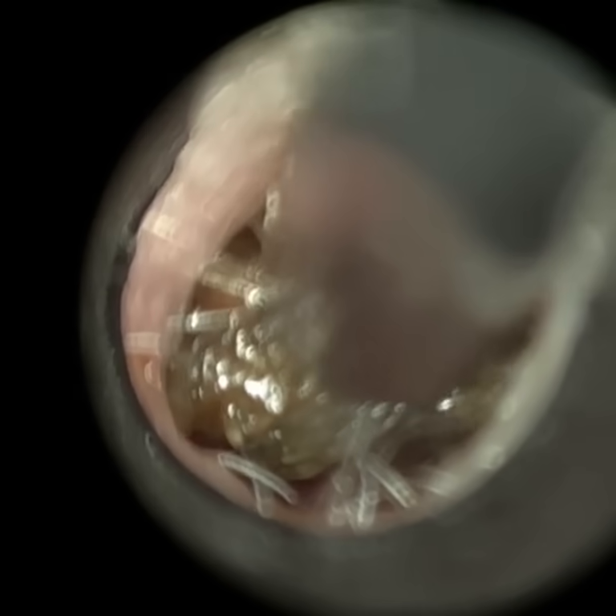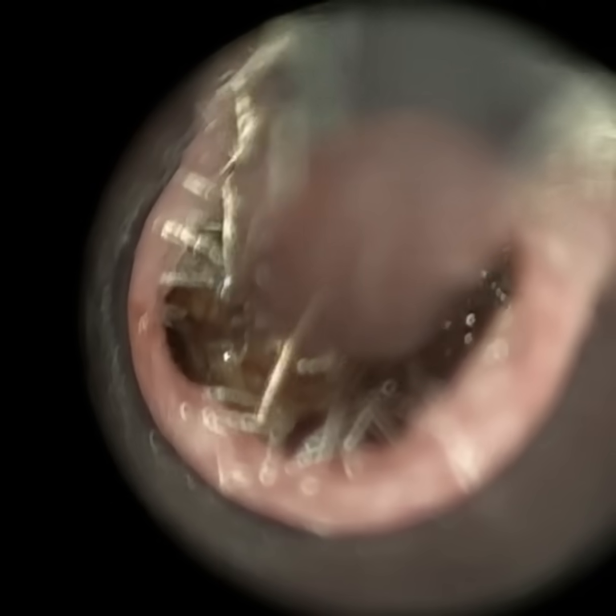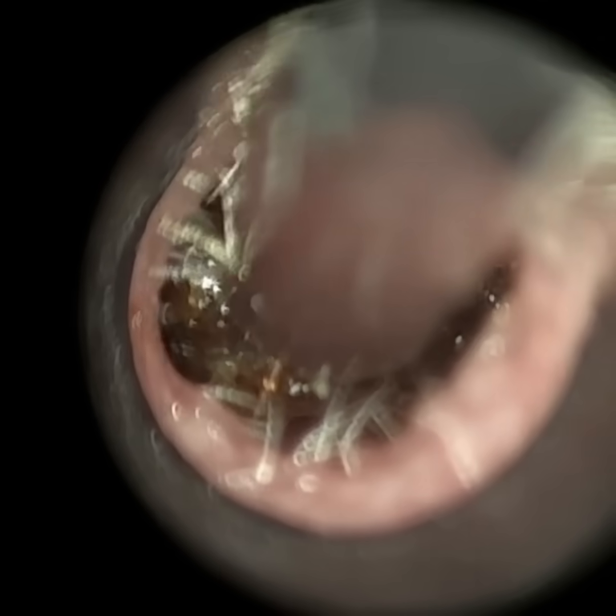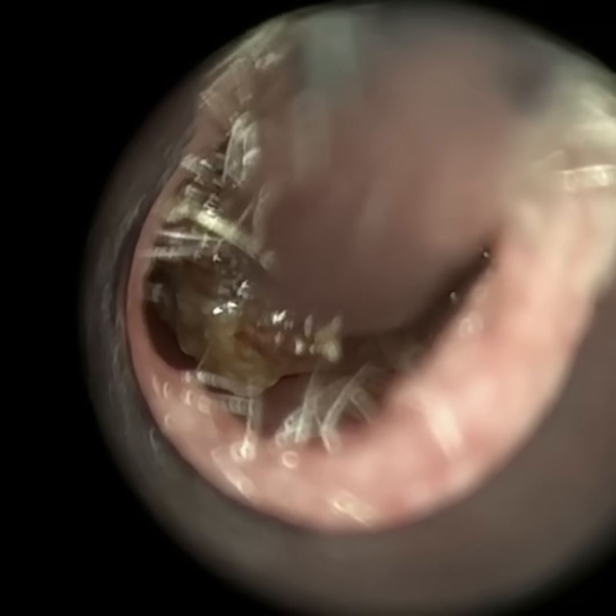And that's because, like with an ENT operating microscope, the lens is outside of the ear. So even with an ENT microscope, you're going to get a similar view. However, it's helping to keep the ear canal open. And that's the big suction probe now. That's the 14 gauge, which I wasn't able to use with the endoscope. But you can see around the perimeter, the black edge, that's the specula.